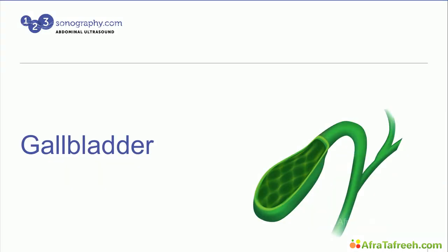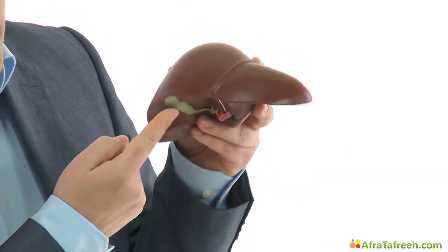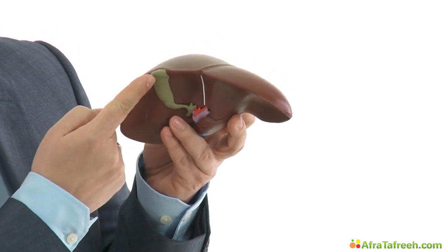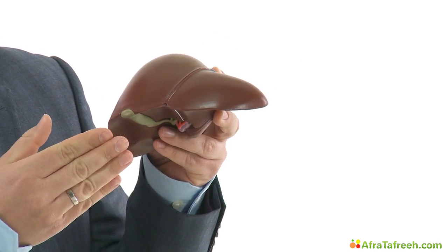The gallbladder causes the majority of severe abdominal pain and cramps in the right upper quadrant in patients attended to at the hospital. The gallbladder can be compared to a balloon which hangs either down below the liver when empty, as you can see here, or stretches as far as the abdominal wall when filled.